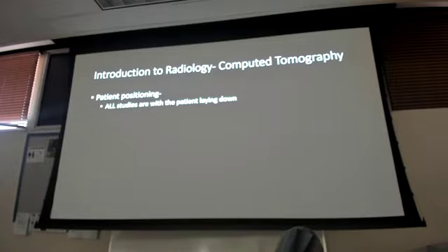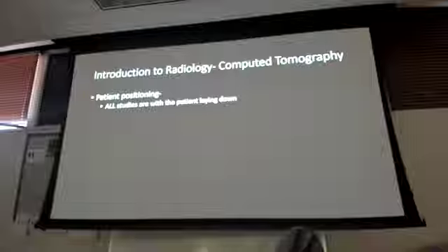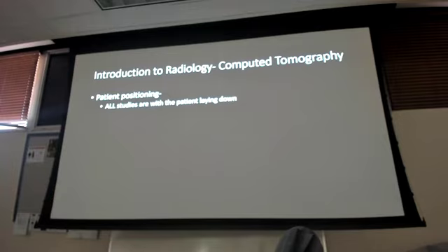So that's nice, because I don't need the patient to be able to stand up to be able to do the imaging, so that gives me more of a range. But it does mean I gotta transfer the patient from the bed to the CT scanner and that kind of thing, which is another reason we stay away from those unstable patients, because transferring them sometimes is all it takes for them to completely code and kind of tank.